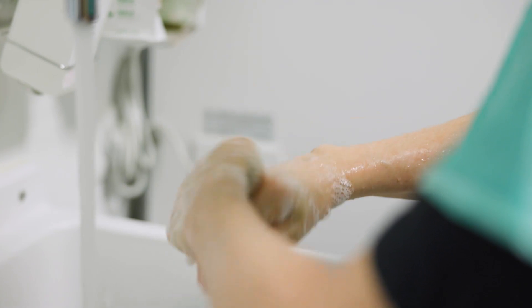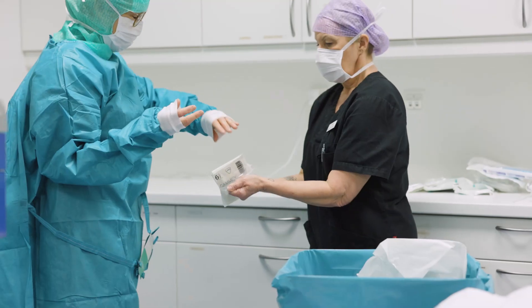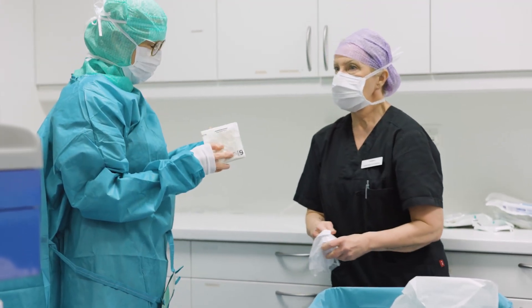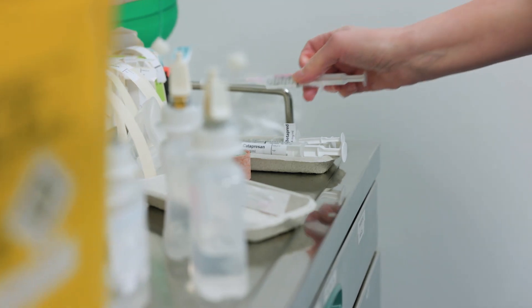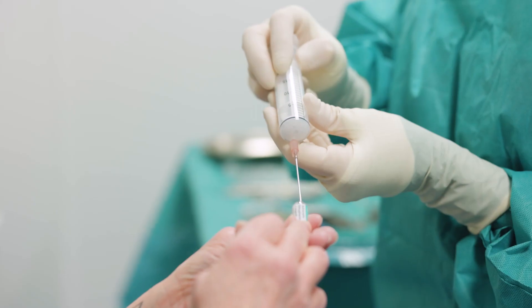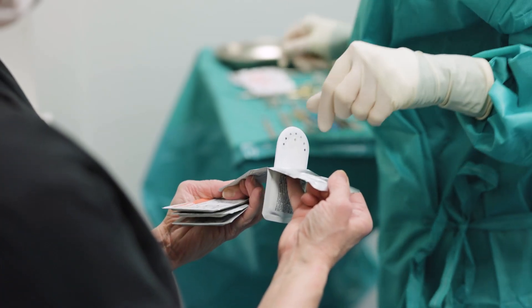Here at Diamond Plastic Surgery we use both intravenous and inhalation anaesthesia. Calculating the effect of anaesthesia during ongoing anaesthesia is a difficult task for both the nurse anaesthetist and anaesthesiologist. It does not matter if we use intravenous or inhalation anaesthesia. Adequate depth of anaesthesia is important because I want my patients to feel as good as possible during and after anaesthesia.